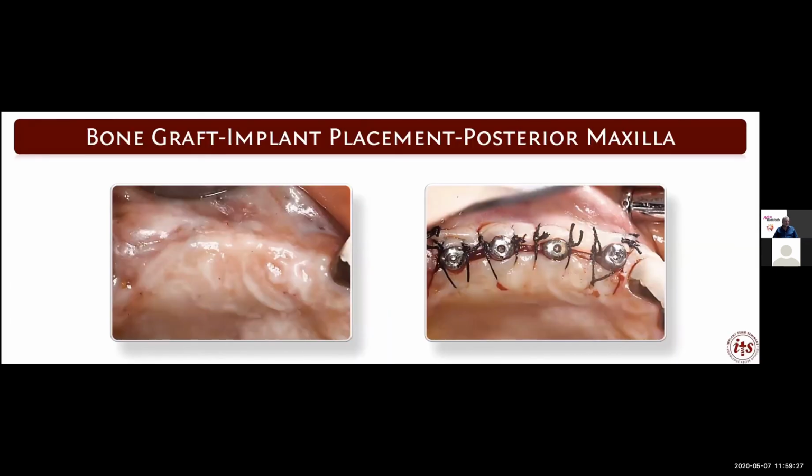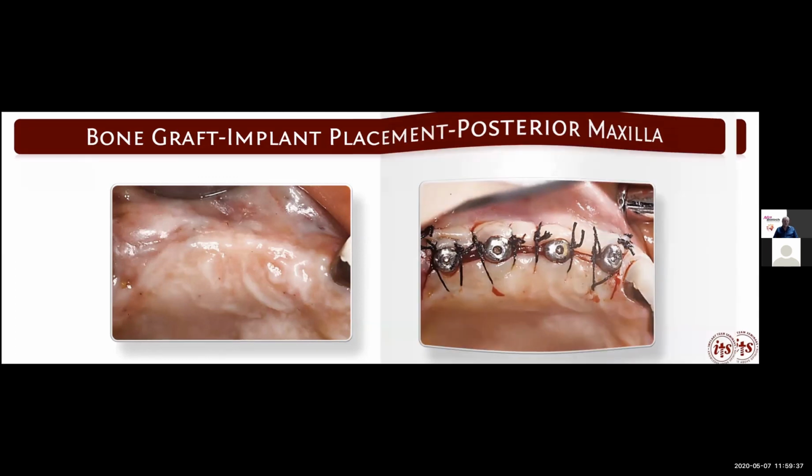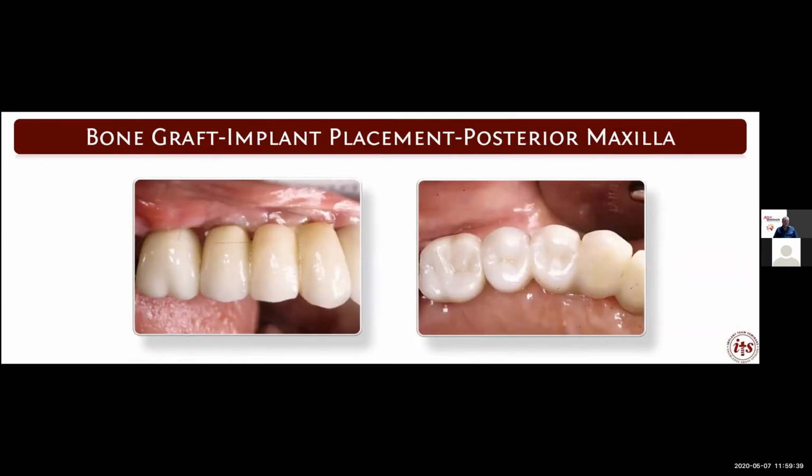So when I come back in these cases and put on the healing abutment, I have no problem leaving a little space between the gingival margins because that's going to fill in with more attached keratinized tissue. And now we have the final case.